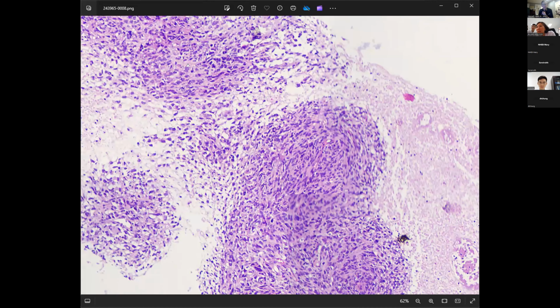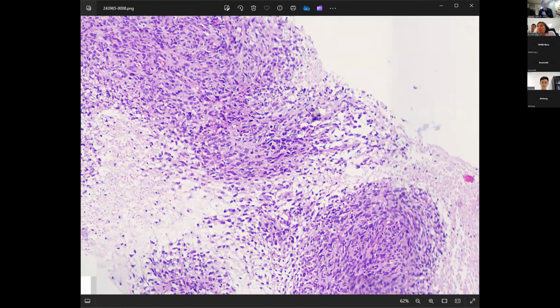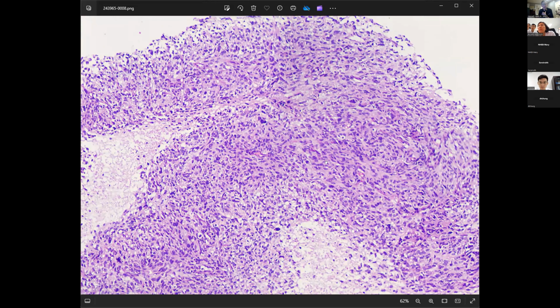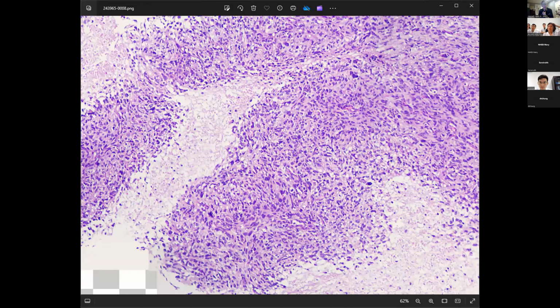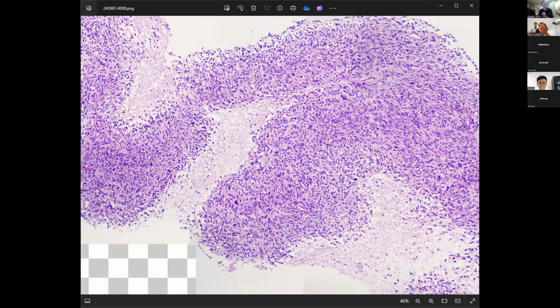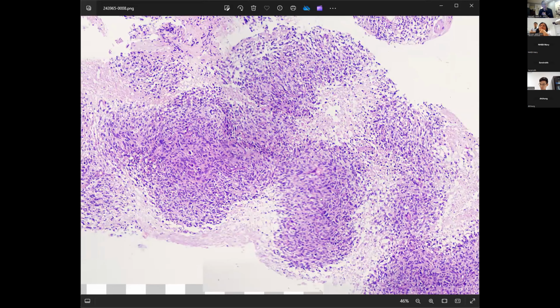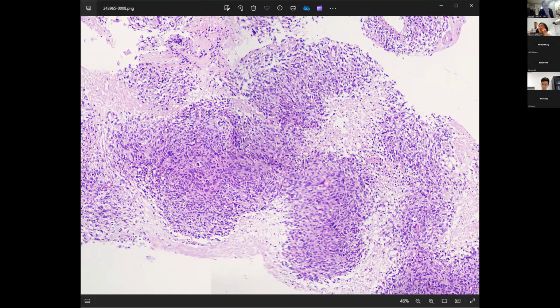And so that's possibly a pattern. I refer to that as angiocentric pattern of growth. And then further away from the vessels, you get the necrosis. That's a pattern. This angiocentric pattern is a relatively uncommon pattern in sarcoma.